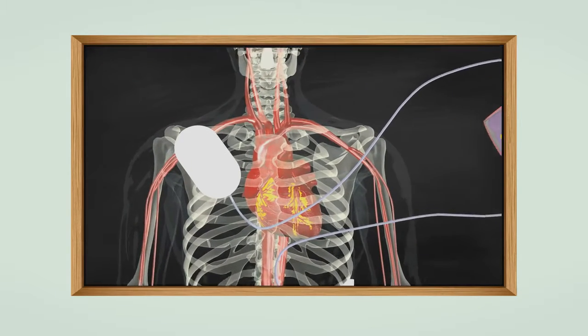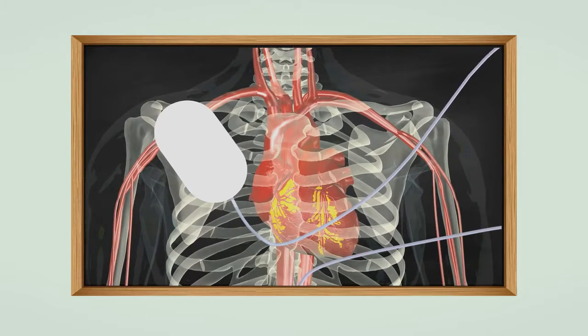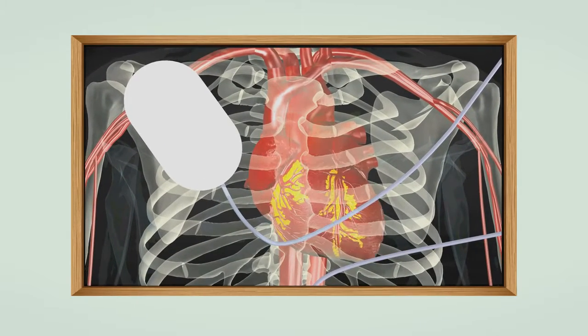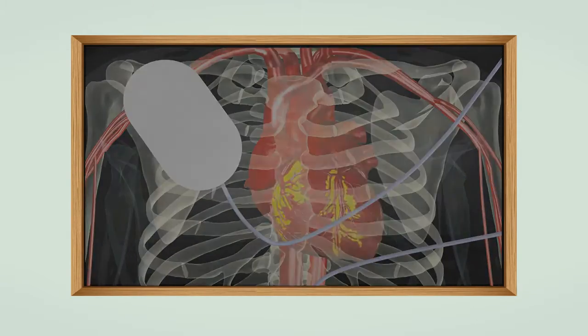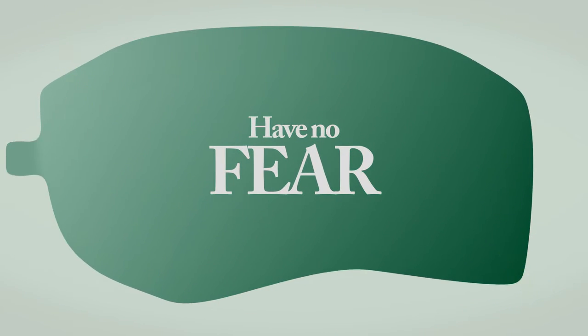Delivering an electrical shock to the heart stops this quivering, or defibrillates the heart, and is a potentially life-saving treatment. The AED provides the shock, enabling the heart to regain a normal rhythm. So, hopefully now it's clear. Use an AED, have no fear.